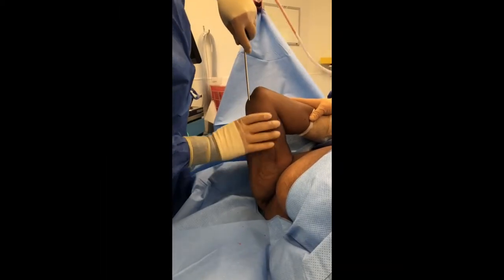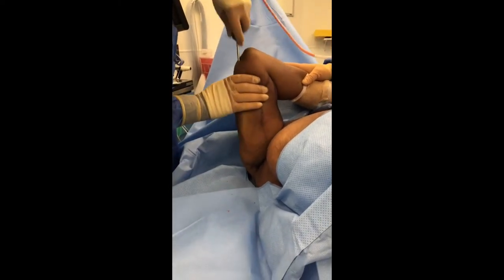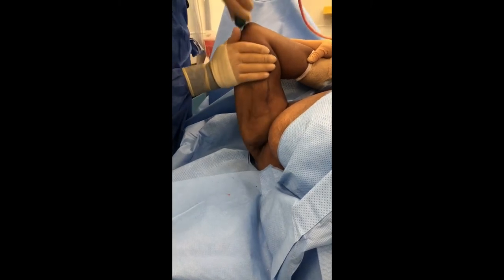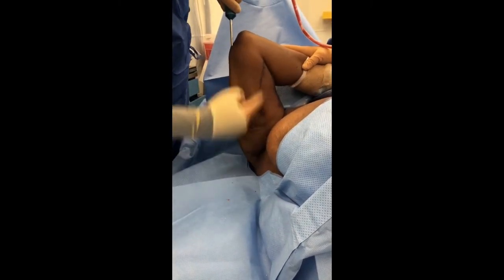The first step in the majority of my arm lifts is going to be posterior arm liposuction. You can see I'm going back and forth behind the arm to get a lot of this fat out and loosen it up, so we get a tighter closure when it's time to remove this arm's skin.